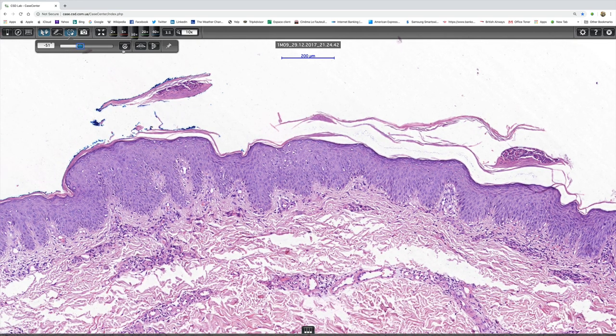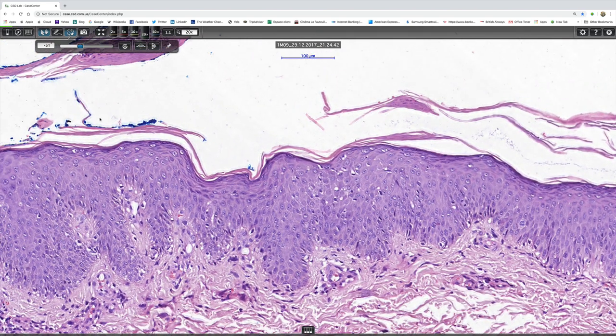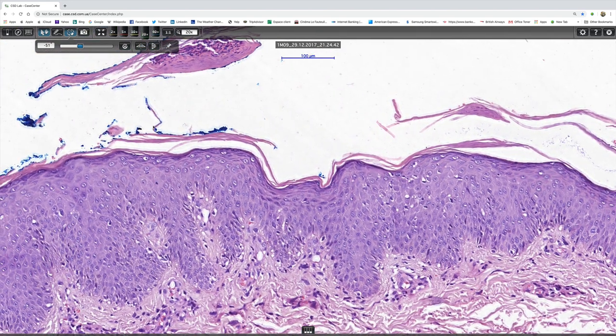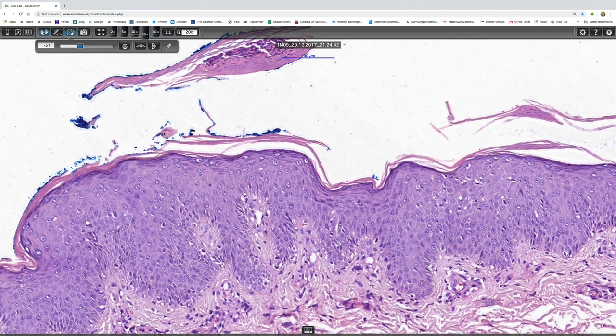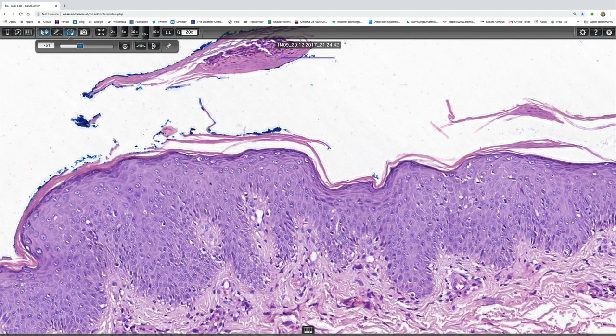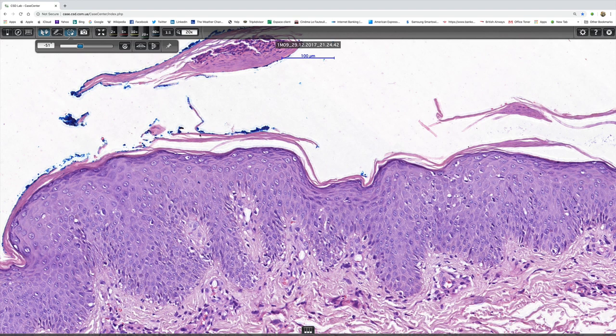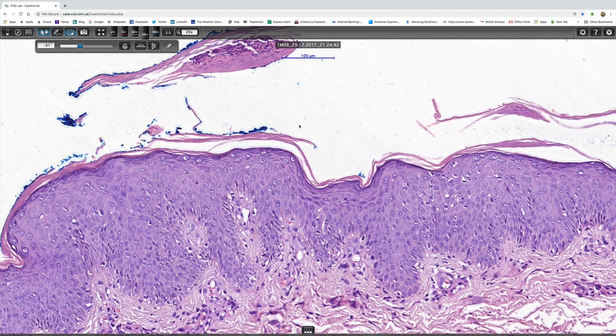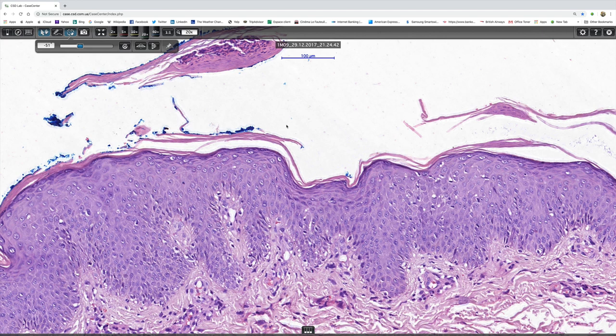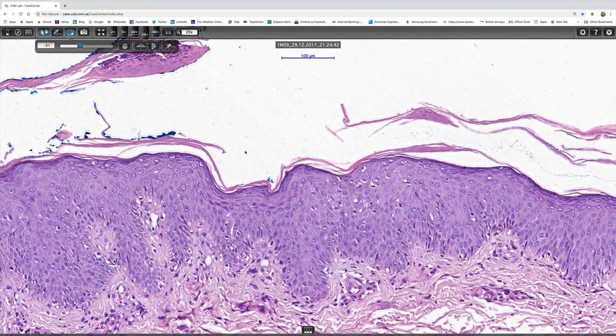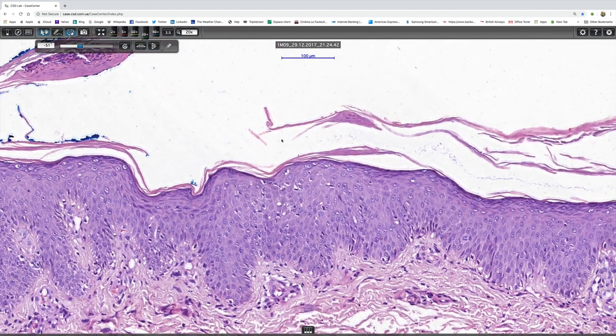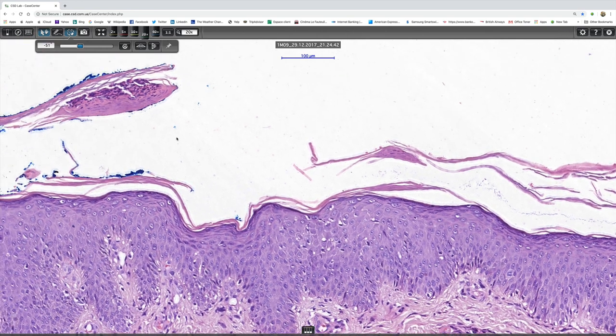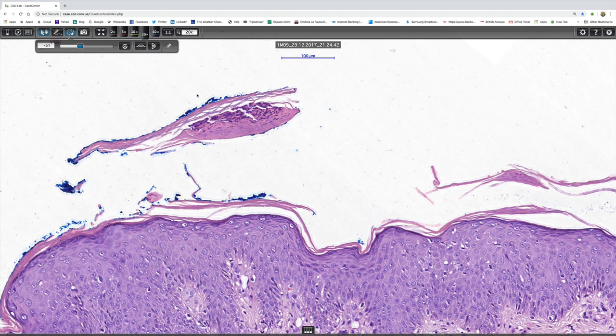Now, it's interesting. If we look at higher power, you'd be hard pushed to say anything much about the granular cell layer. It's certainly not obviously lost. But then, of course, we've got some lamellar hyperkeratosis underneath. So that would fit quite nicely. And if we look here, there are the neutrophils.